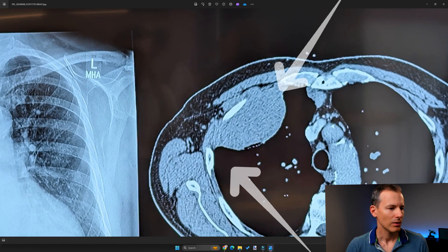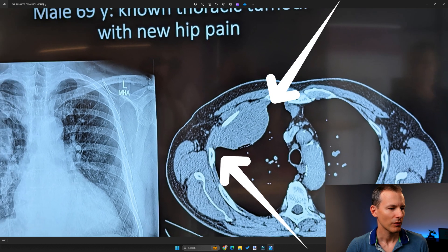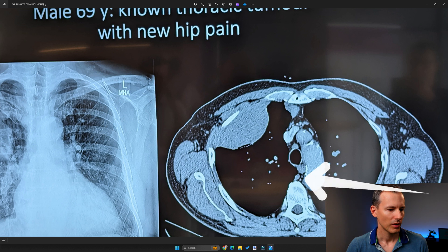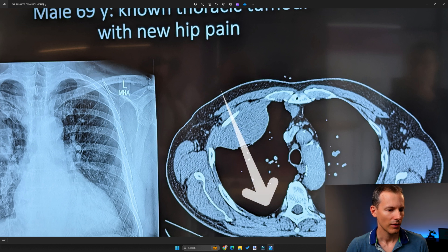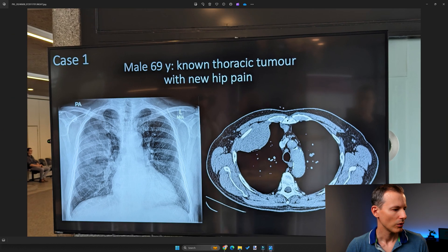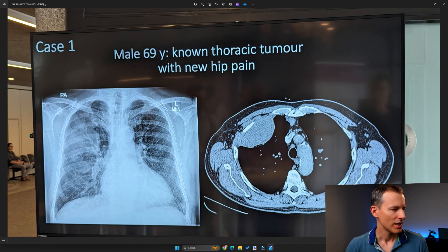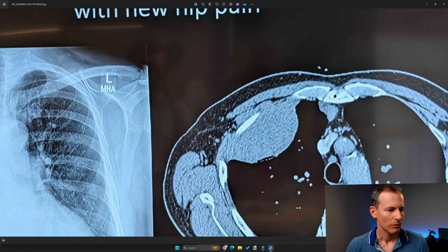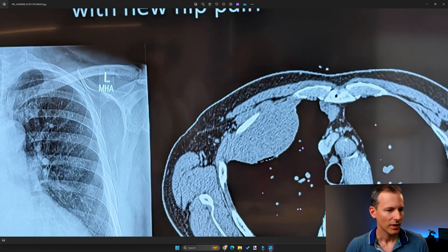If we zoom in based on the angles and go through the details: we can see the angles here, there may be some other structures, and what appear to be just vessels. We don't see anything on the other side, there is no pleural effusion — also not on the radiograph — no other lesions, and from what we can see on the radiographs I don't see any osteolysis. We can potentially see a bit of sclerosis of the rib.